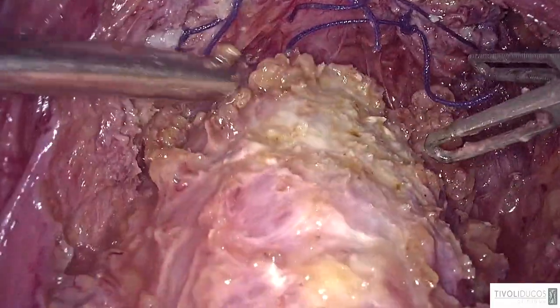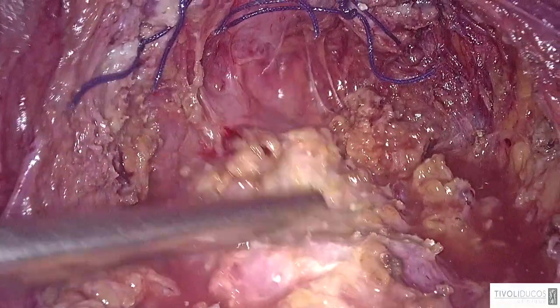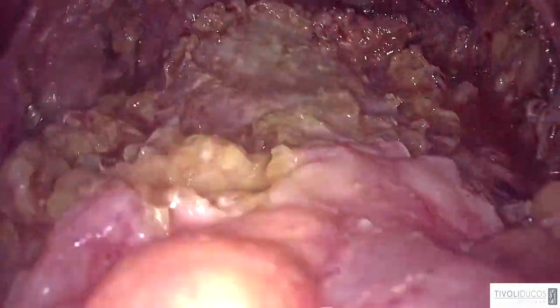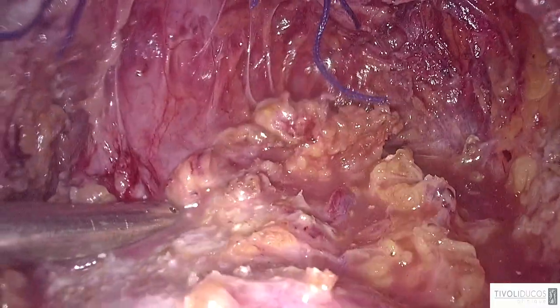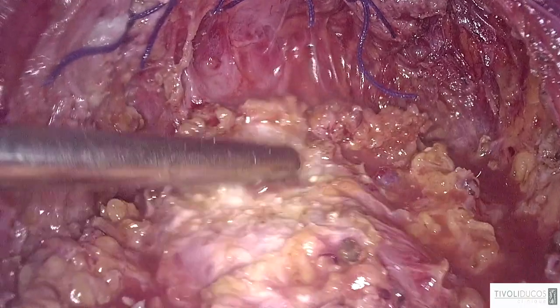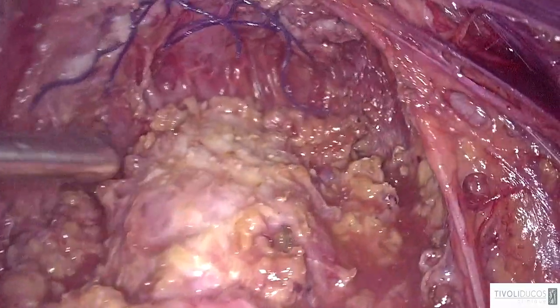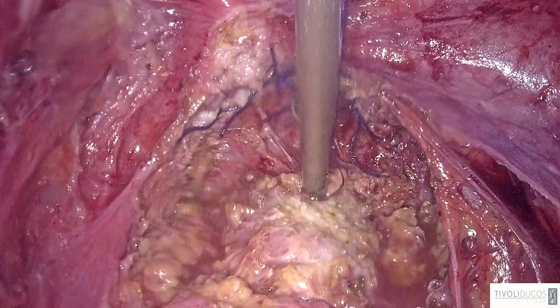Right. So, here I prepared the rectum, and you see it is soft now. The next step will be to put a stitch here at the inferior limit and another on the superior limit in order to be able to push the shaved area into the stapler. So I will put the stitch.